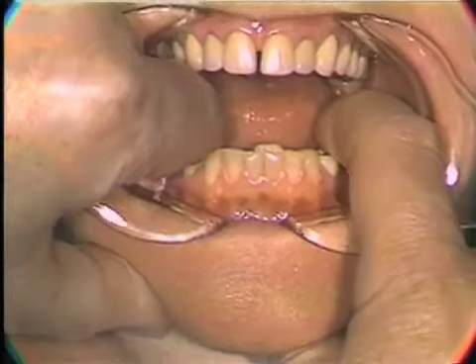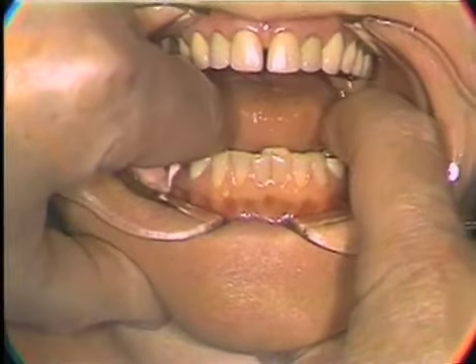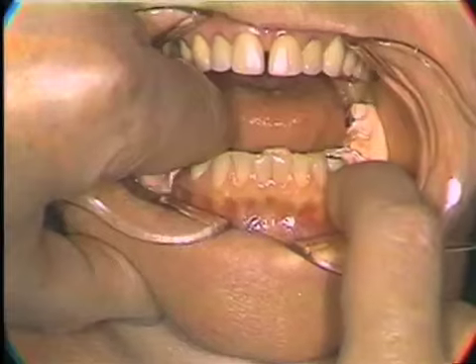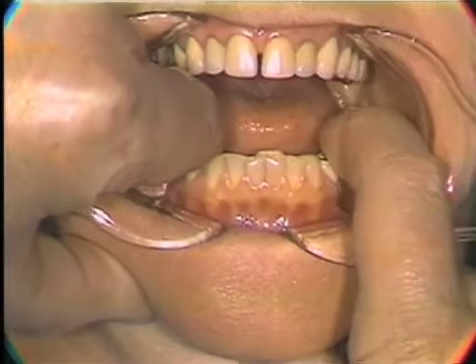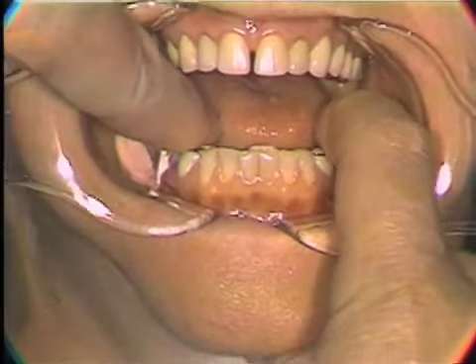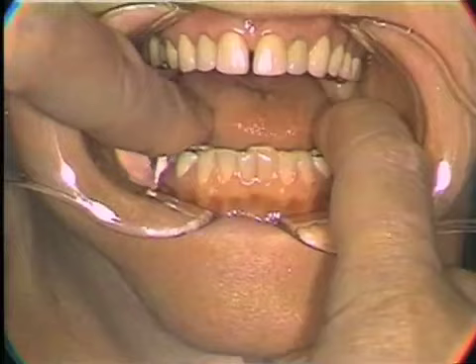Apply a vertical force on this side, and we'd observe whether the opposite side is coming away from the tissue. There should be no movement of that base away from the tissue. If we have this, then we can be sure we're on the way to a stable base.